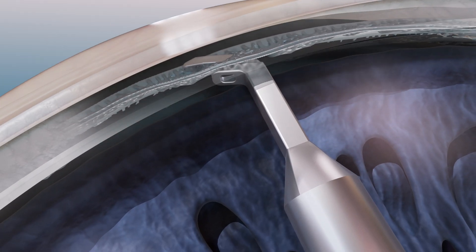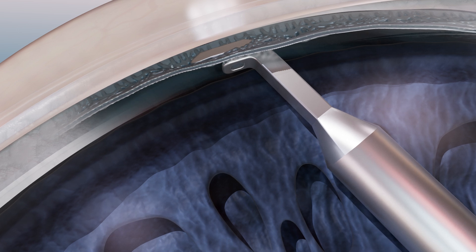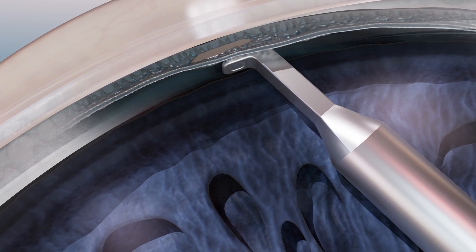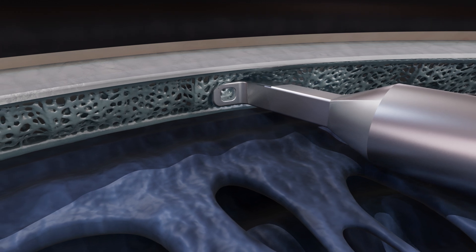The lower foot allows for ease of placement, coming to a rest against the scleral wall. Nestled into position, the upper foot of the device will find itself resting atop the trabecular meshwork.